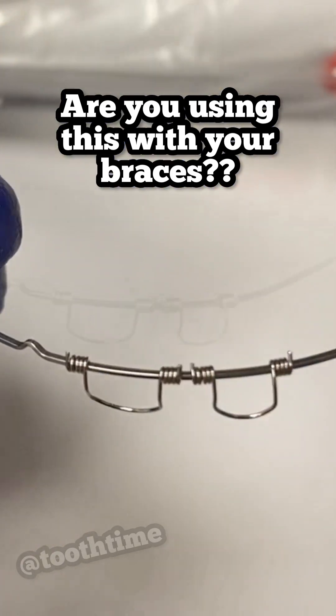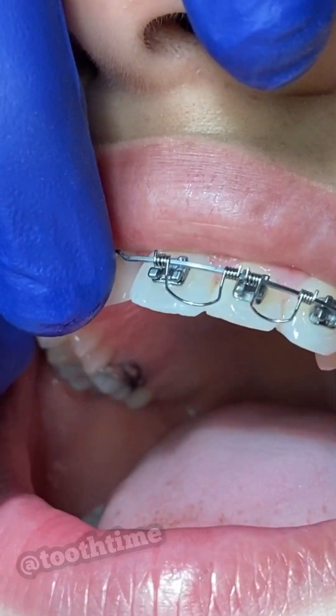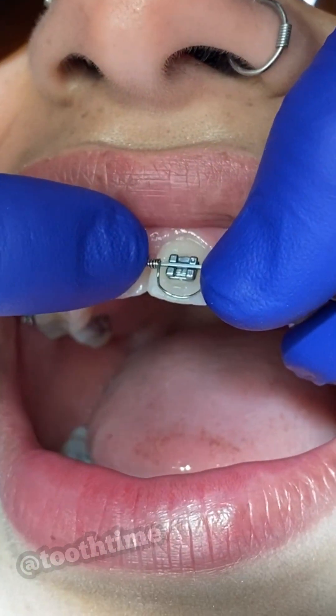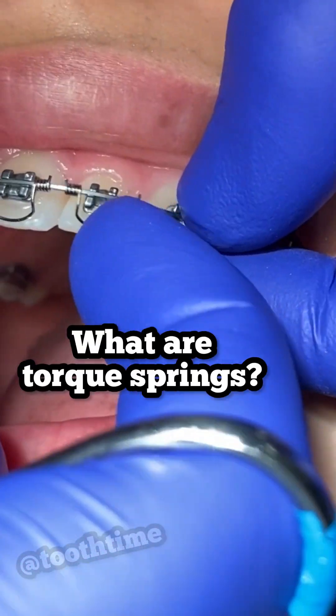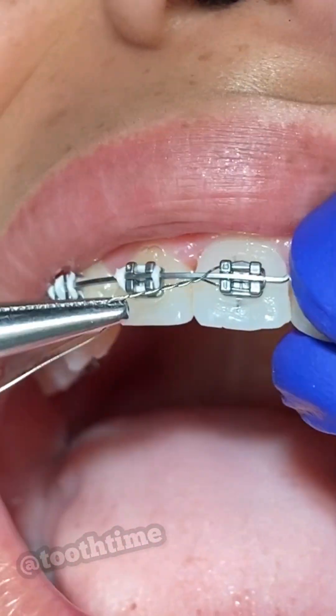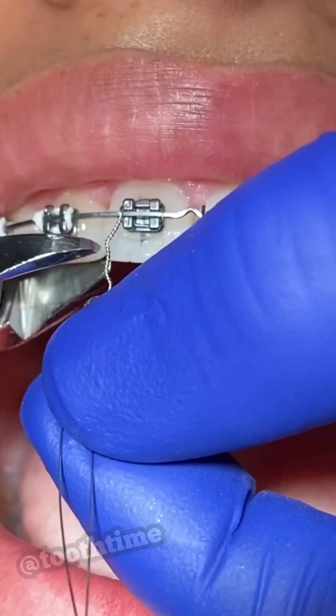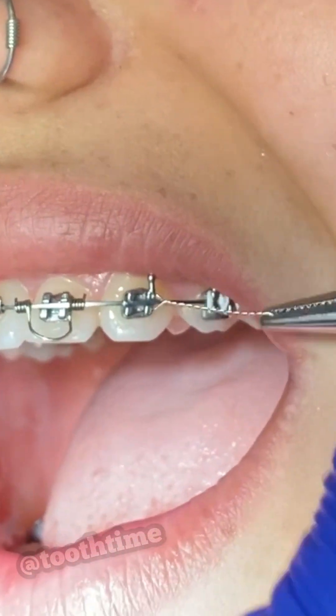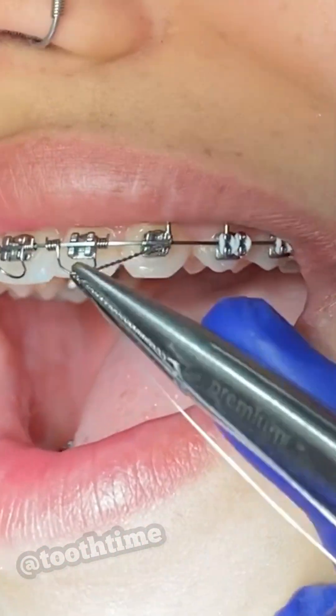Hey everyone, this is Abby, your hygienist here at Tucan Family Dentistry. Today's video is pretty cool — we're going to show you how we place torque springs. Torque springs are a method we use on isolated teeth that need to be rotated or inclined, meaning more lingual, towards the throat.